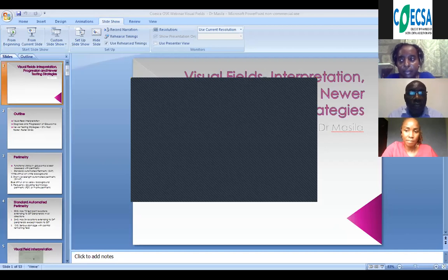Okay. Then Dr. Kipsang here asks about disability forms for tax exemptions. Yes, so we do the visual field for them, we do the 24-2 and the 10-2, and then we classify that in the WHO classification. Then, like in a hospital, we give them a note for visual impairment. So depending on the 10-2, they're eligible for visual impairment.